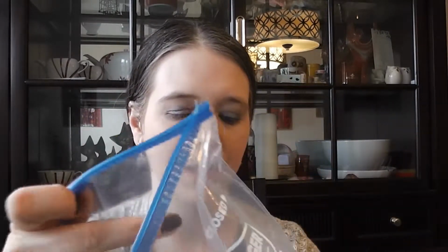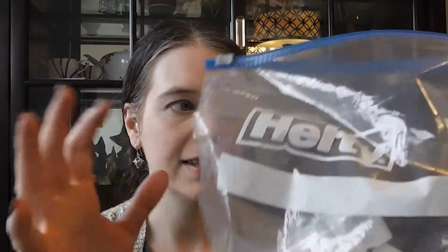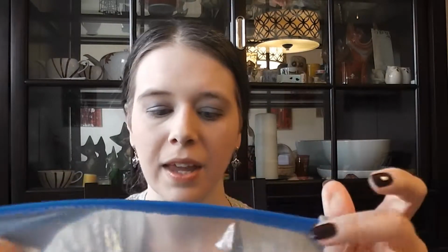I put my pump supplies, I only have one that's clean, so I don't have 2 to show you, but put them both in here, and then I'll put 2 lids in there so that when I'm done I can just take off the top and put the lid on the bottle with the milk. I like to do this because if there's any extra milk in the supplies, it'll keep it from getting all over the bag. So it just keeps it all contained and together. And it keeps these clean before I actually use them, because probably the inside of the bag gets dirty over time. I will reuse these. I wash these out every night and dry them so that I can reuse them several times before throwing them away, so it's less wasteful.